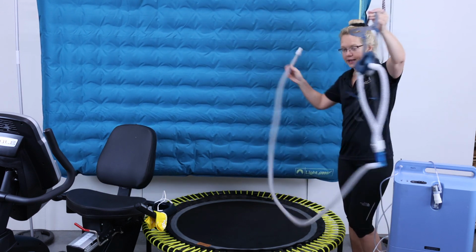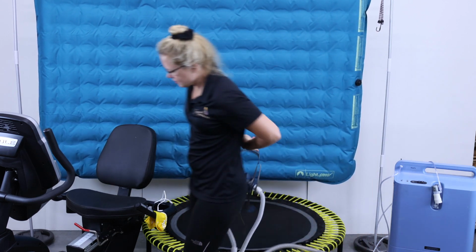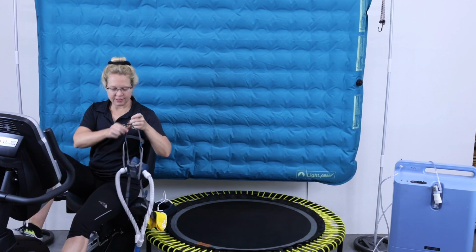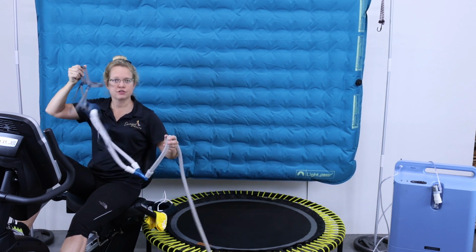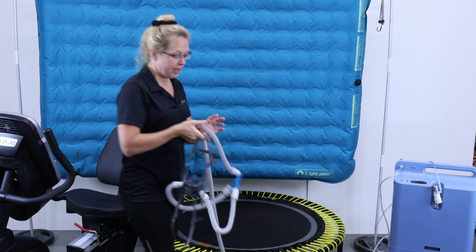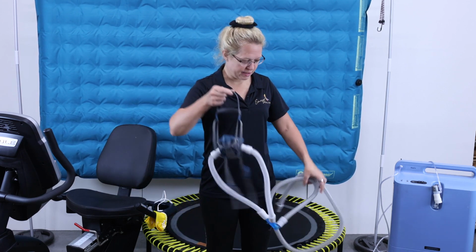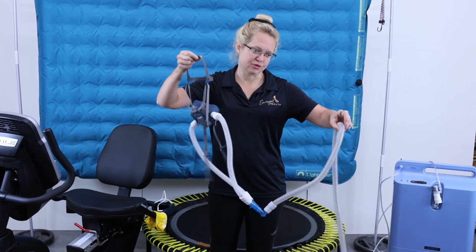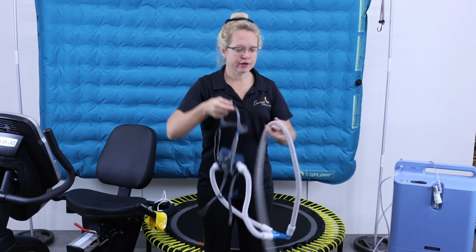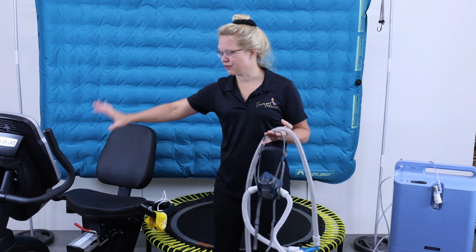Once your hose is inserted, make sure you buy a long enough hose that it'll reach from your reservoir to your exercise device. In this case, as I'm demonstrating here, recumbents are nice because the hose is not bouncing up and down. Your head is in one spot and there's no bouncing, so a lot of people find that a lot easier to exercise with. The other option is treadmills or ellipticals, which work really well too. At times I've seen the hose taped or bundled somehow to get it out of the way on the railing of the treadmill, so it's looped over the treadmill. So you'll have to worry about hose management a little bit, but it's not that big a deal. I found it's pretty easy to manage, especially if your head is still.